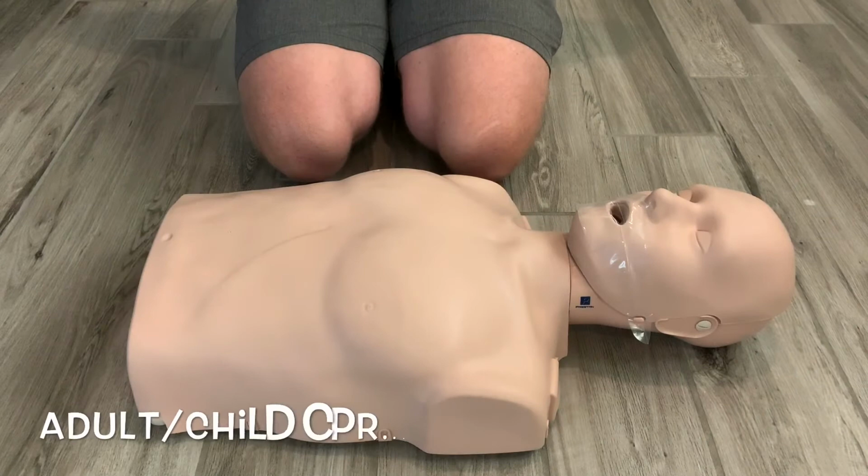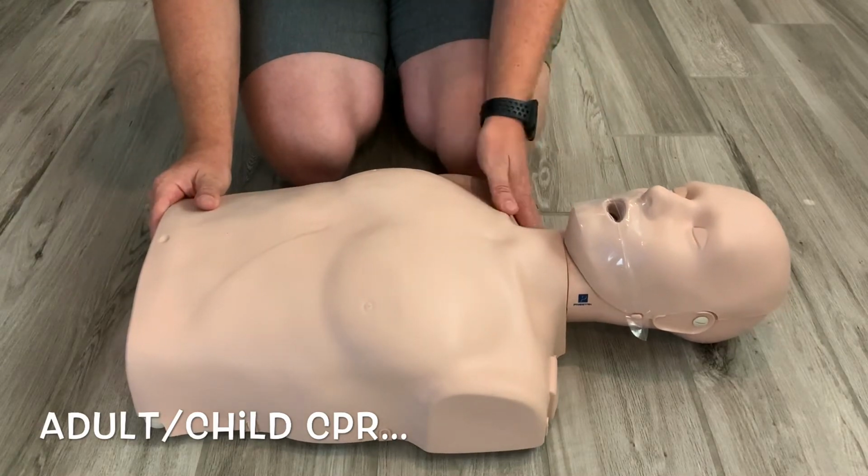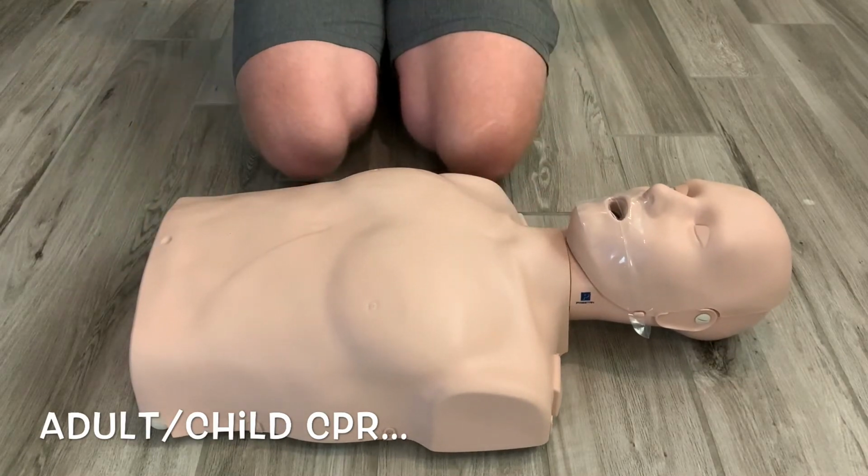In this video, we are going to discuss CPR for a child or an adult. That's anybody over the age of 1. Step number 1 is check responsiveness. Hey, are you okay? Hey, are you okay? If this patient has no response, we want to tell somebody, hey you, call 911 and get an AED.